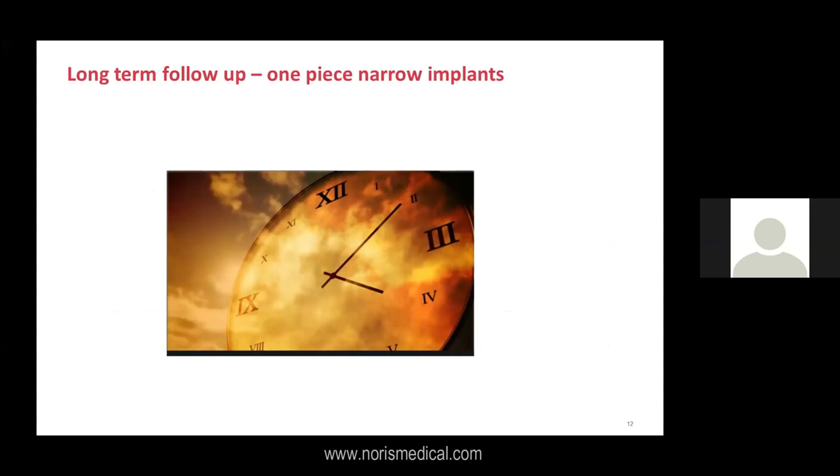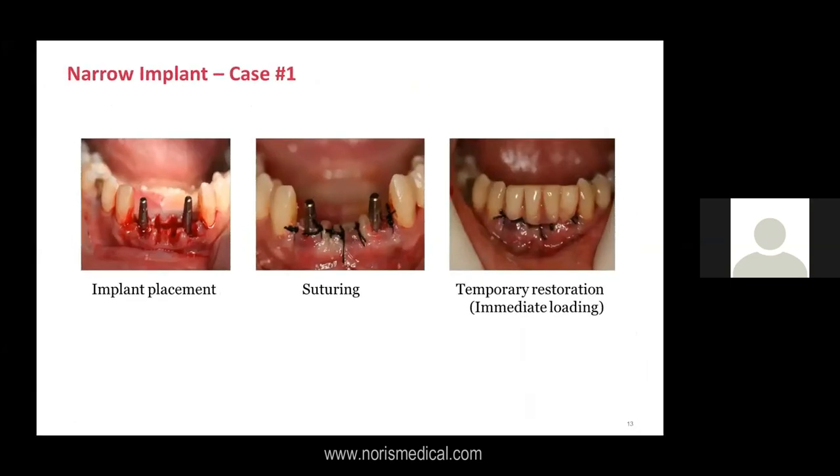I'll show you some cases in order to show you that those implants have actually been in the market for 20 years. When we started, we didn't use these implants in a wide variety of uses in the jaw. Here I can show a classical case. It's not mine, it's my friend's case. Here you can see still the silk sutures. It was done something like 20 years ago.